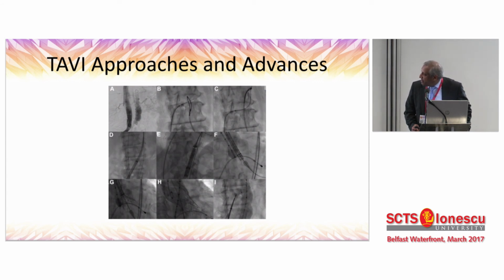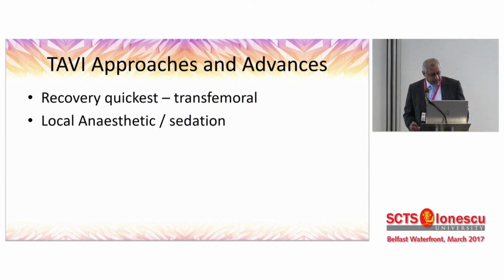Yeah, they just summarize the various steps in the TransCAVAL. It looks very complicated to me. I haven't tried it, but it's been described.